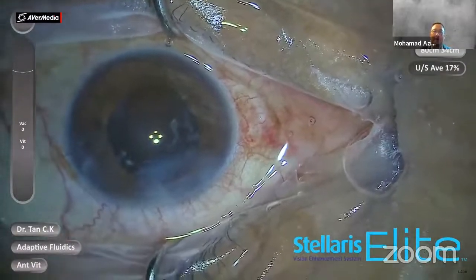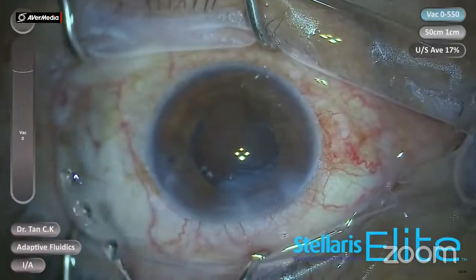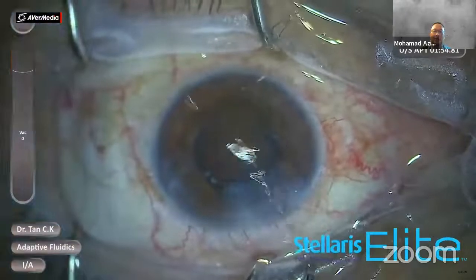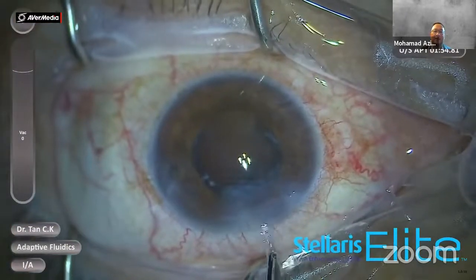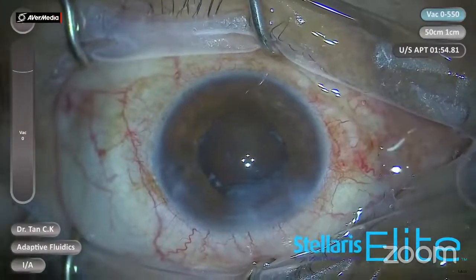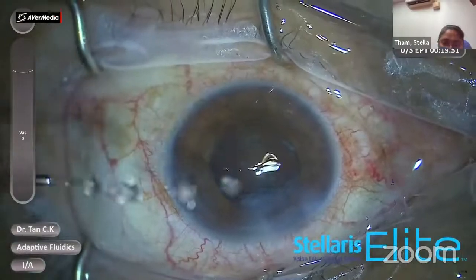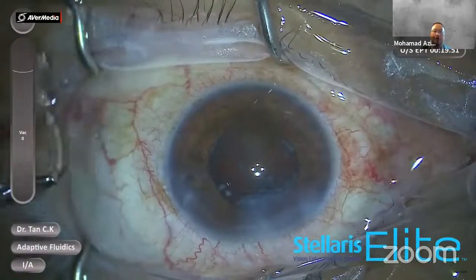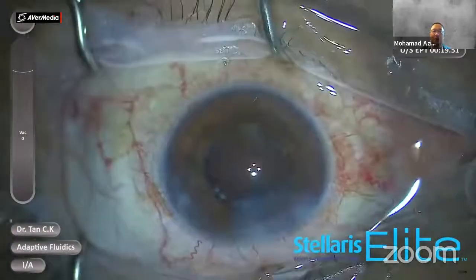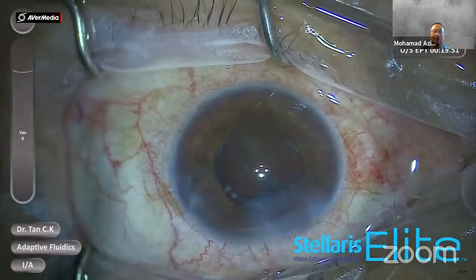But in good hands, they don't normally extend the wound because they have to keep the vitreous within the closed cavity, small wound. They don't want to extend. Okay, depends. It's all about prevention of PC rent, isn't it? So your right hand shouldn't be moving to pick up all those pieces. You should just stay.